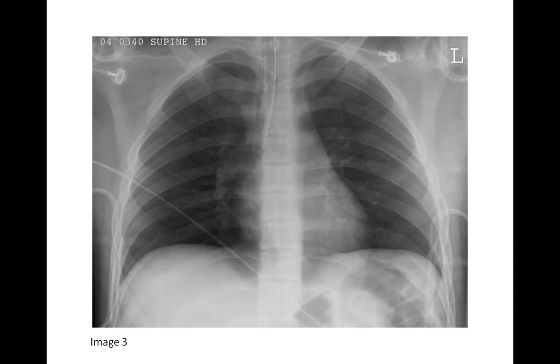Next, we've got this patient's film. Obviously, this patient is intubated, and if you look carefully, they're intubated in the right mainstem. This is a major thing that everybody needs to be able to pick up. If that is a right mainstem intubation, it needs to be pulled back. For one thing, if you don't pull it back, you're going to get left lung atelectasis because the left lung is not being ventilated. All of the volume is going into the right lung, and there's a potential to generate a pneumothorax if we overdistend alveoli. So the response there is that you definitely have to pull that back.